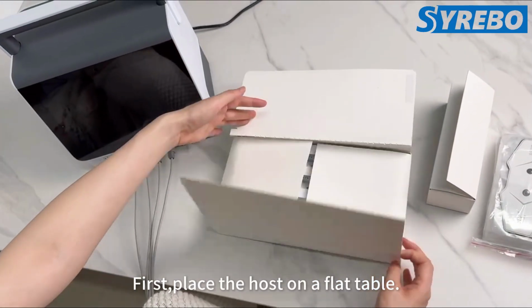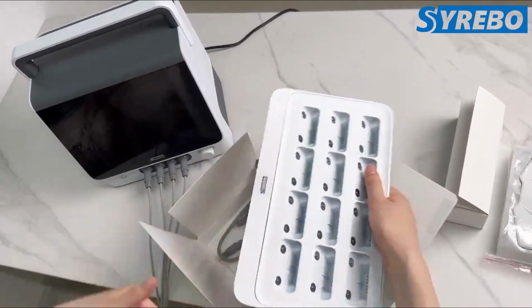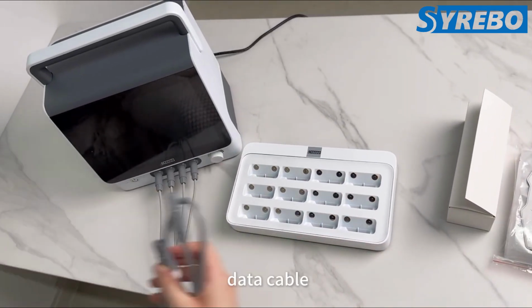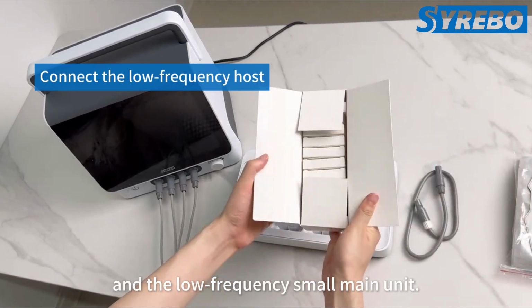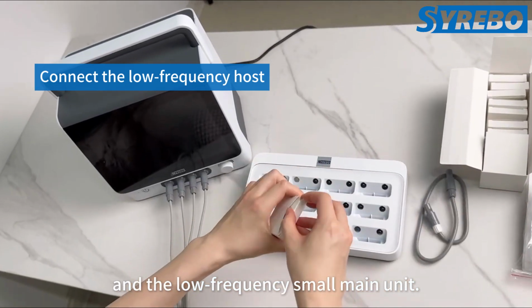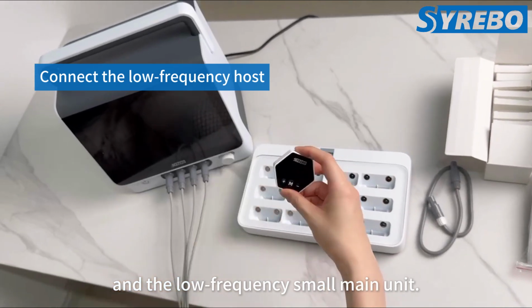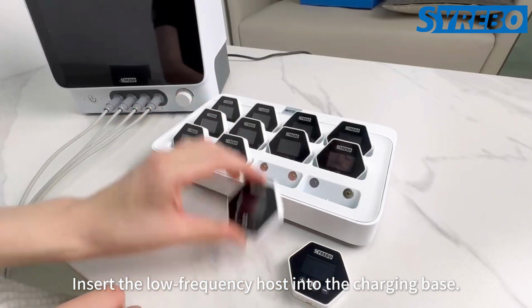First, place the host on a flat table. Next, take out the charging base, data cable, and the low-frequency small main unit. Insert the low-frequency host into the charging base.